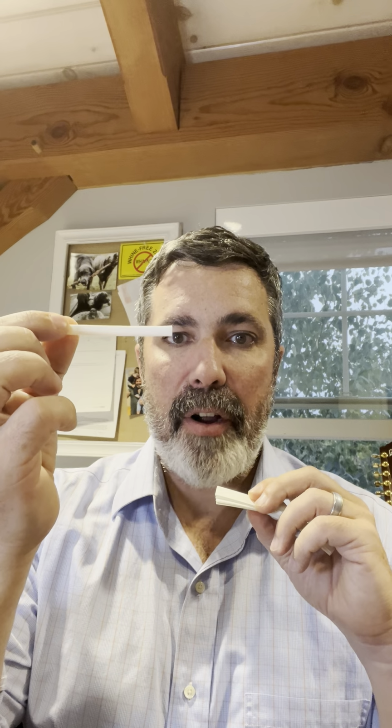And then what you want to do is put that in the posterior of the patient, have them bite down, and whatever size they have in the anterior is what you're going to want to use to select whatever tool you have to best approximate that.